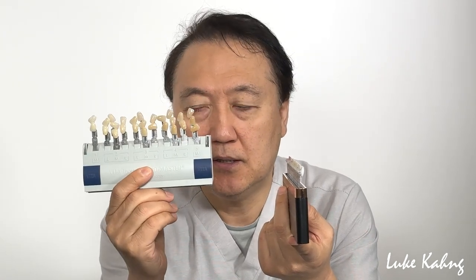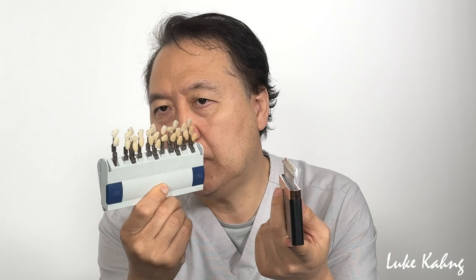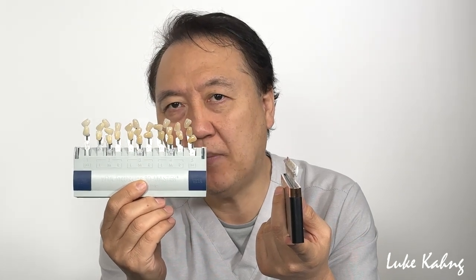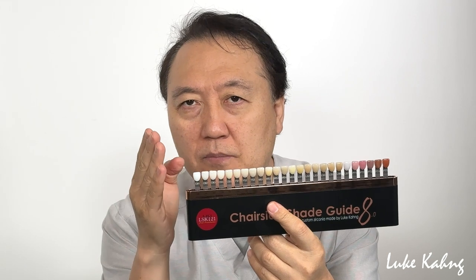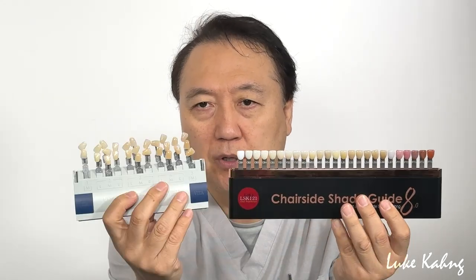This is the popular shade tab, which is great, but it's 4, 5 millimeter thickness. Whenever you're matching the teeth with this shade tab, it will not match the patient's natural teeth, because the dentist prepped the teeth to less than 1 millimeter thickness. Therefore, I made this less than 1 millimeter thickness. This really makes sense to get the value compared to the prep color.